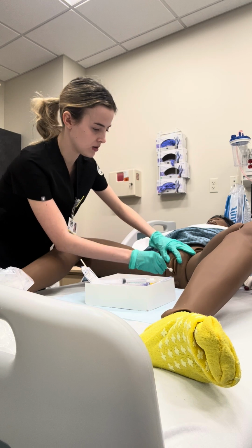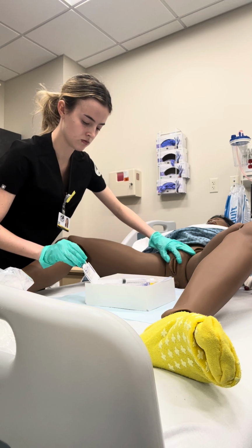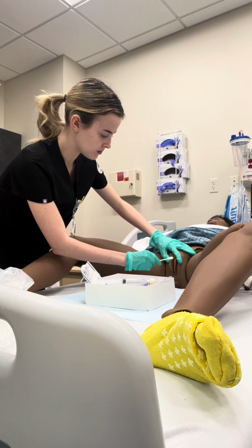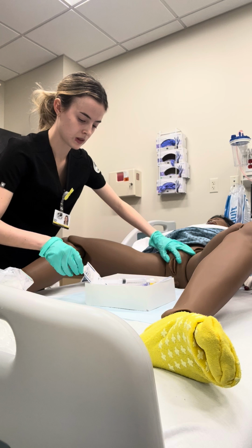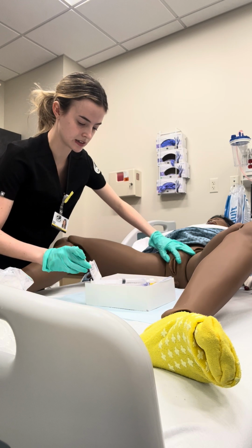One wipe down. I'm going around the sterile field. Drop it in. And last one, I'm focusing on cleaning the urinary meatus.